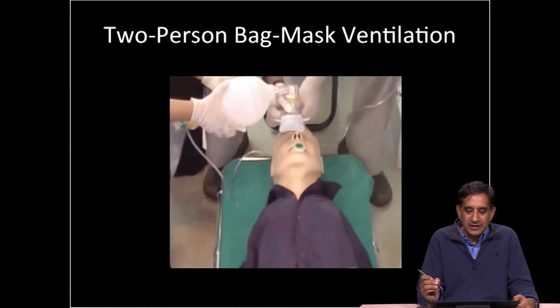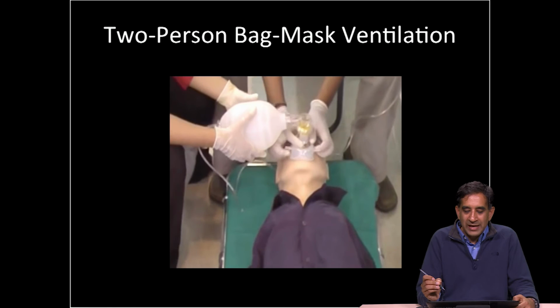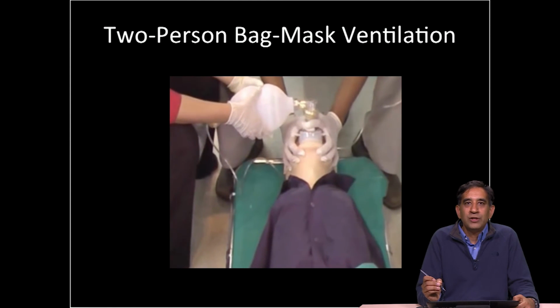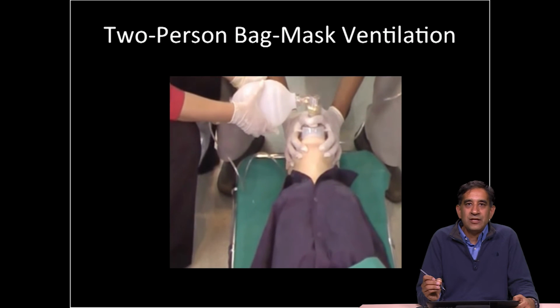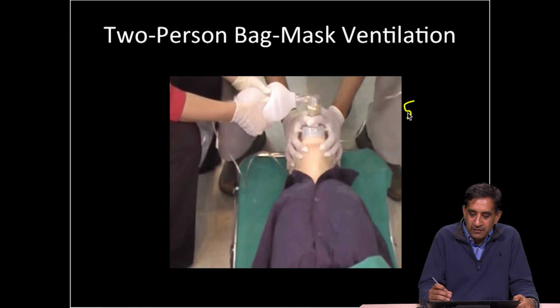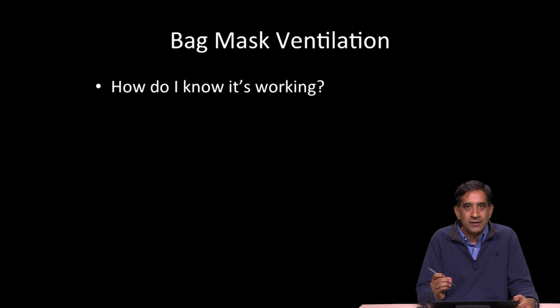So how does this look again? You're going to get the appropriate mask size, place it on the patient's face, and then you're going to push down on the mask and make a good seal, open the airway, and then your second provider is responsible for providing ventilations or squeezing the bag. Remember again, in the average adult, you're going to give anywhere from 500 to 600 milliliters of air with each breath, or about half of that 1-liter bag.